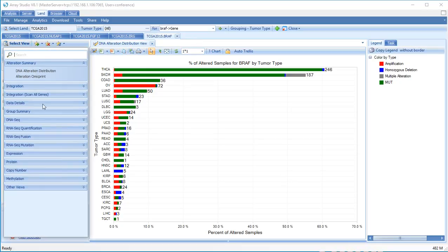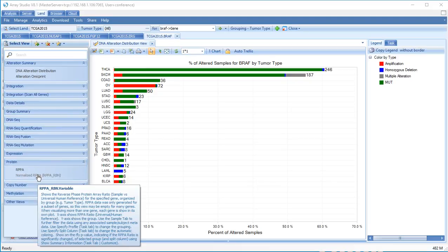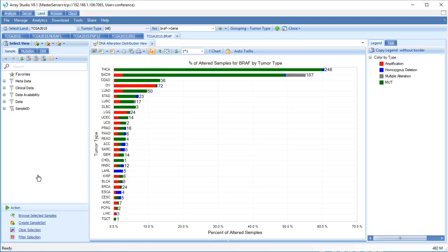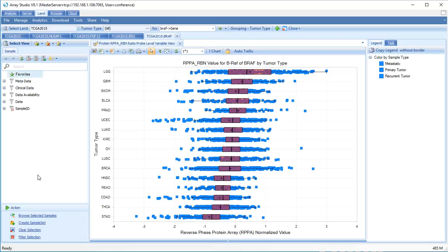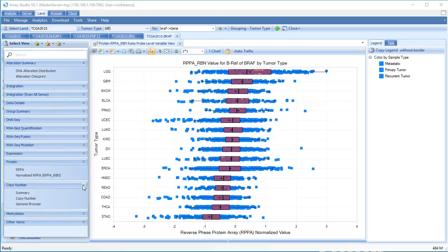Under protein, click Normalized RPPA to see how protein levels change in tumor types. Copy number variations, measured by Affymetrix SNP data, has several views to see copy number landscapes. Click Summary to see what fraction of samples have an amplification or deletion event for BRAF.